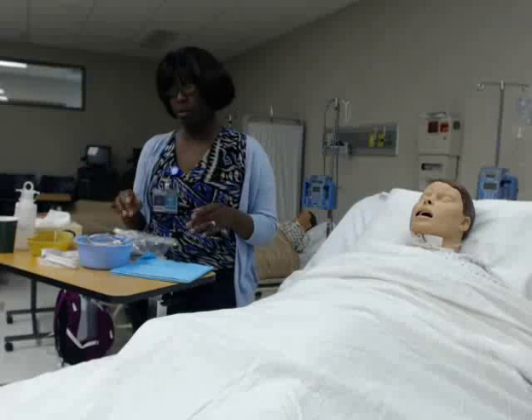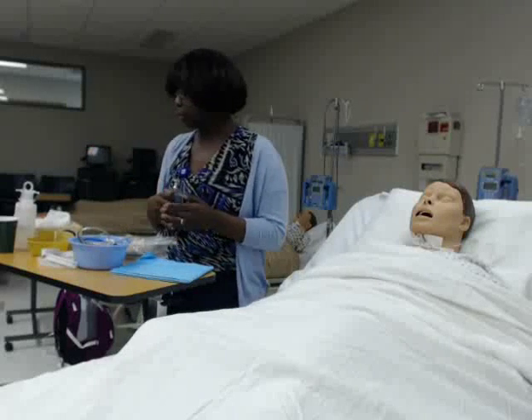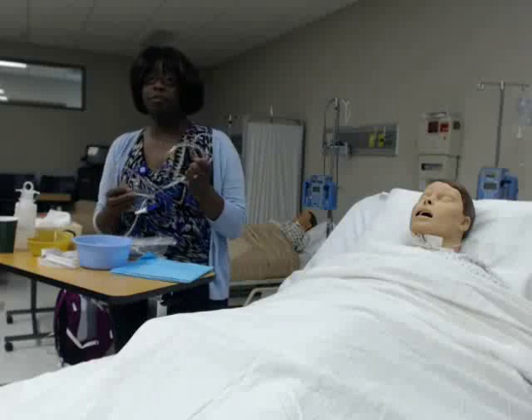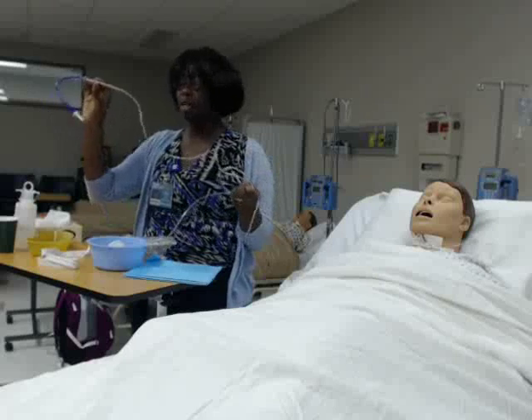We still want to be as clean as possible. Your first step is making sure that you double check your orders and pick the right tube for whatever you need to do. So if you have to do suction on this patient, you want to make sure you have what we call a Salem sump.